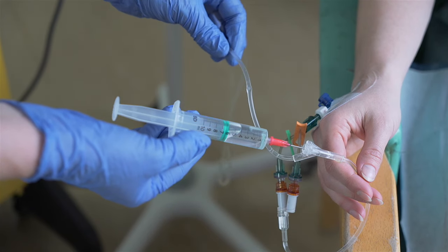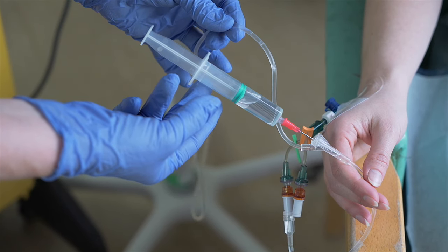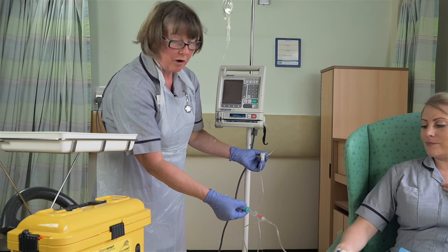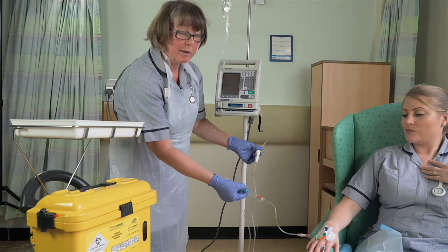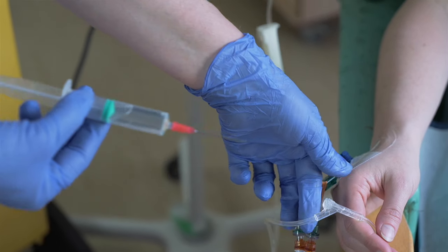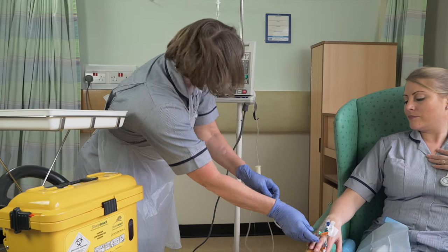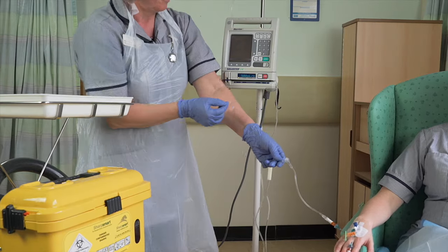As you can see, air is now coming into the syringe. And you will monitor the progress of the air through the tubing, knowing that it is not going into the patient. Remove the syringe, open up the tubing and press start.